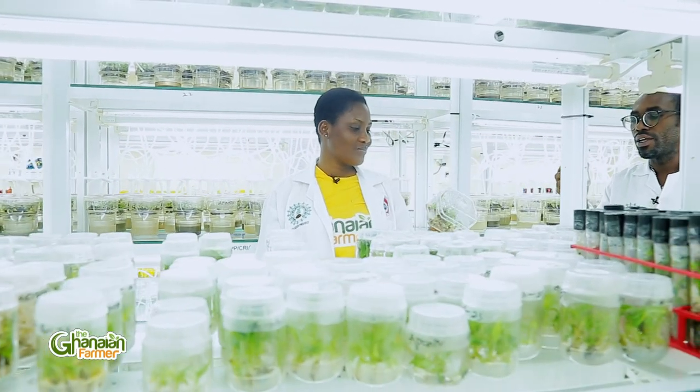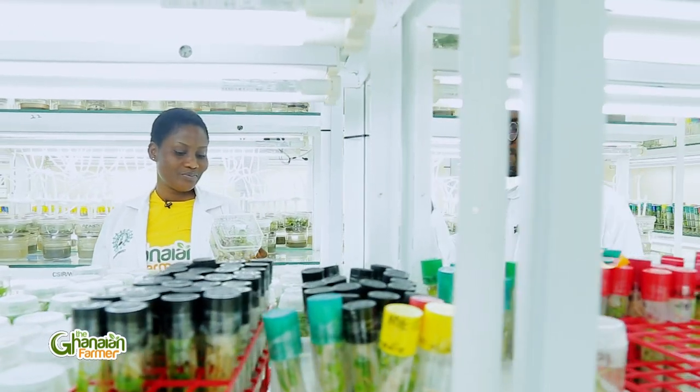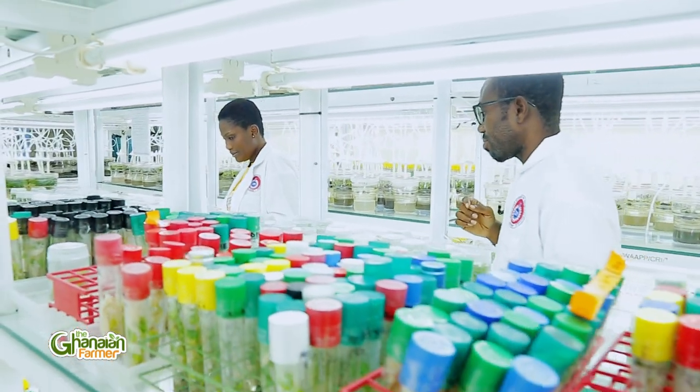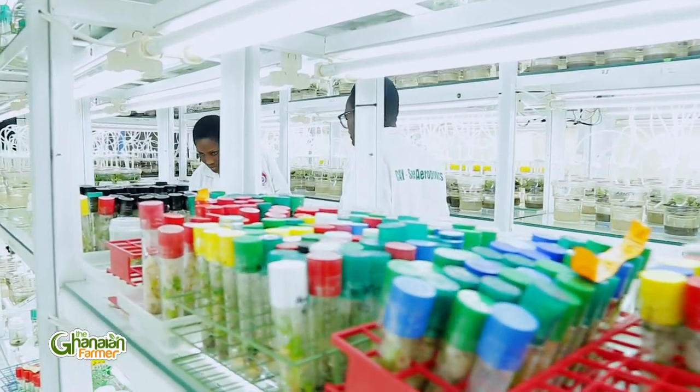Are there examples of plant tissue culture? Each plant part has growth at the node, so what we normally use is taking the node. We also have what we call the shoot tip, and in the shoot tip, we have what we call the meristem. We use all these things to grow and clean the plants.